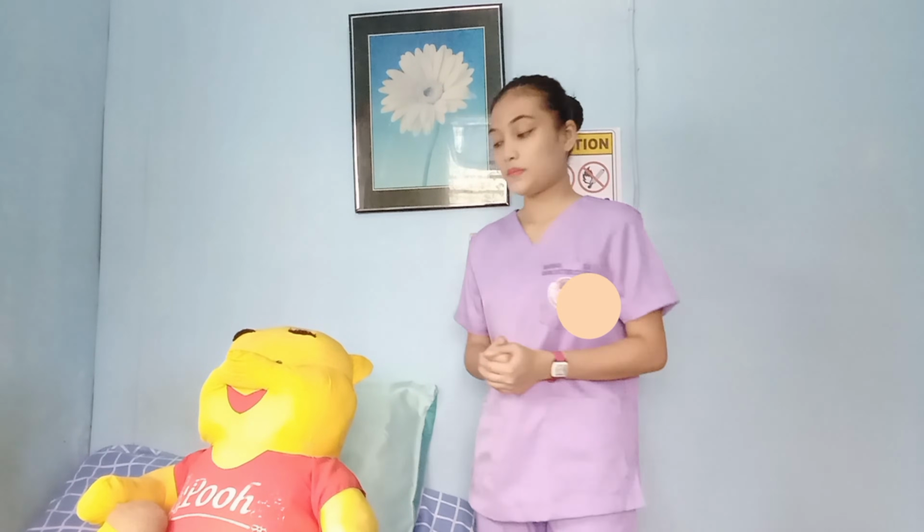Now, the preparation phase is done. I am going to proceed with the performance proper of the administration of oxygen therapy. For this part, the first thing to do is to introduce myself to my patient, verify my patient's identity, explain the procedure to the patient, why it is important and how he can participate, and discuss the effects of oxygen therapy to be used in planning further care or treatment.